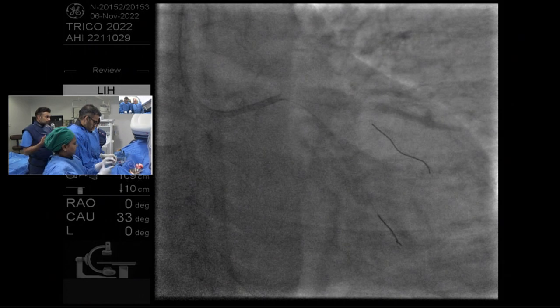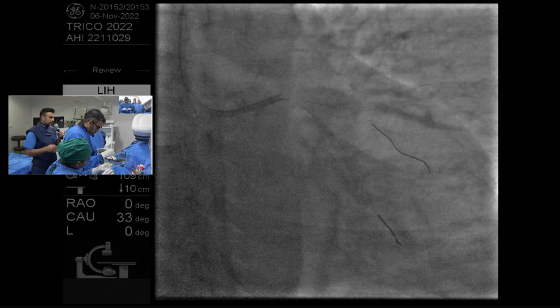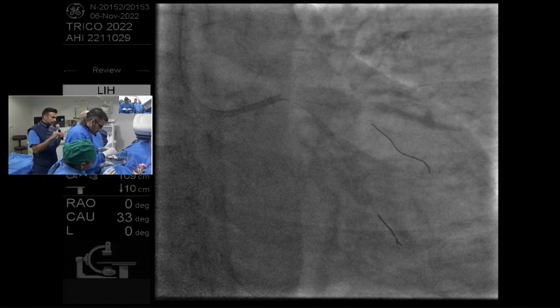Then you just pick a stent that lines up with your proximal or your distal landing zone, and you deploy. It's easy. That's the beauty of this procedure, is anybody can do it.